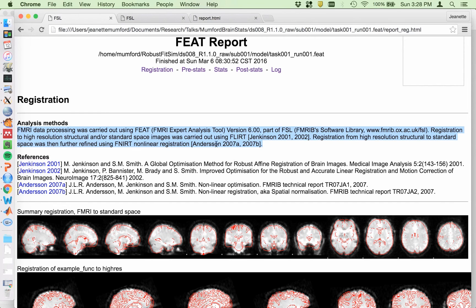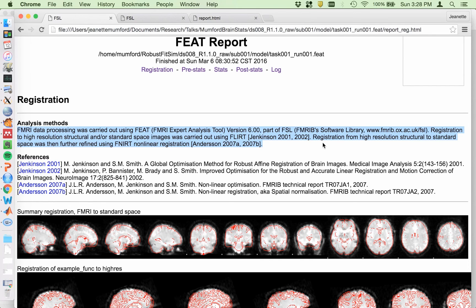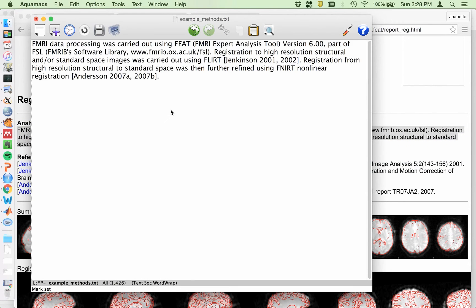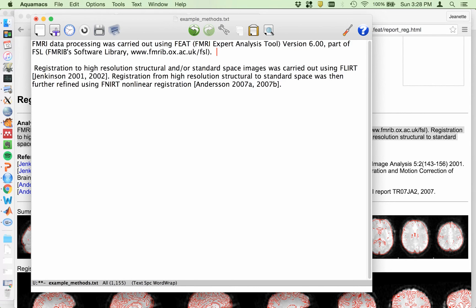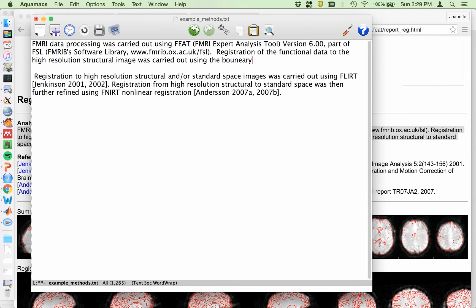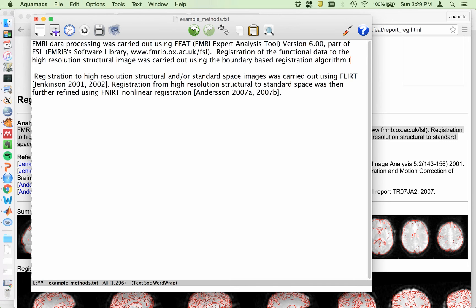so we're going to edit that. But FLIRT is used for the subject structural to the MNI template. And on top of that, FLIRT was used, and that's what the second part is talking about. So I'm going to copy this, paste it here, and I'm going to edit this. Registration to high resolution structural and or standard space. So registration to, first let's add the bit about BBR. Registration of the functional data to the high resolution structural image was carried out using the boundary based registration algorithm.